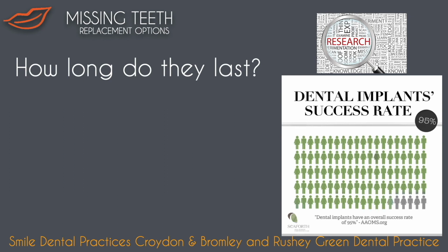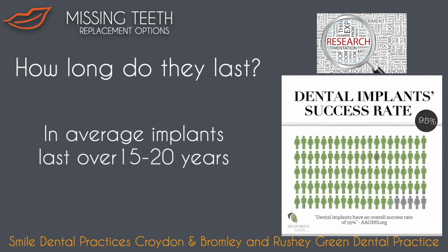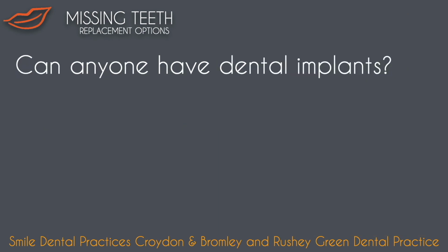Dental implants enjoy a high success rate. The success rate is above 95%, and on average, implants last for over 15 to 20 years. Can anyone have dental implants? Dental implants are suitable for most adults, considering that they are in good general health and they have healthy gums.